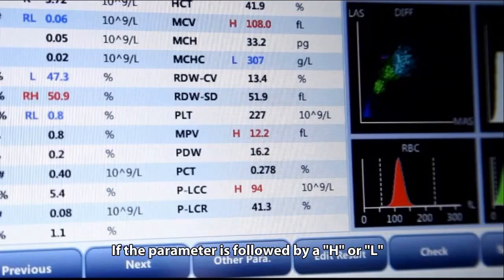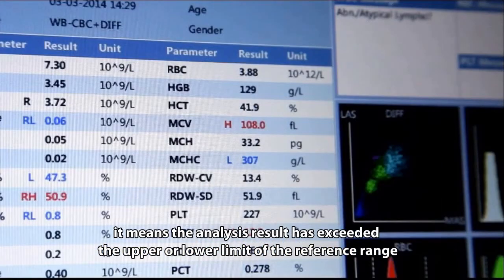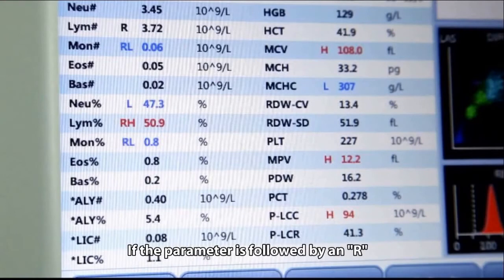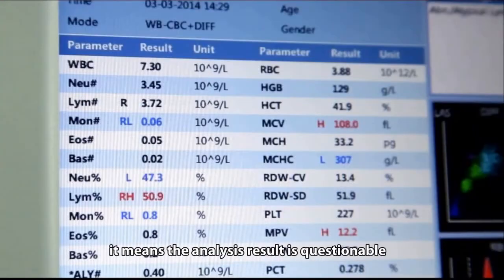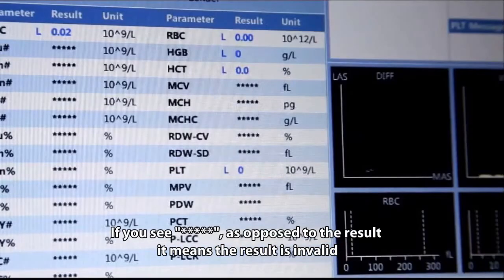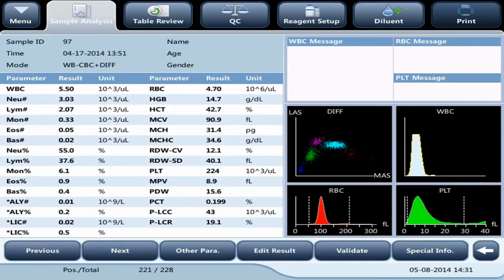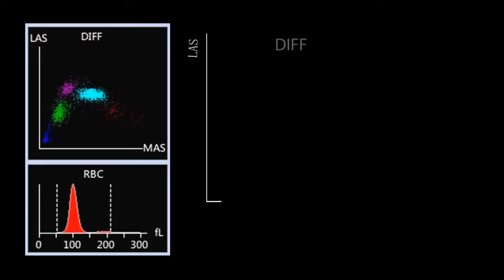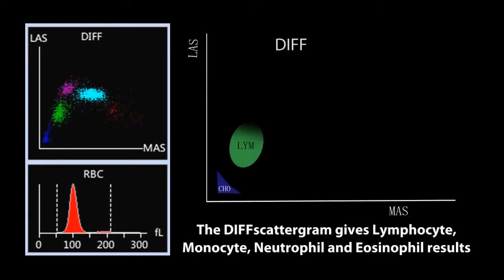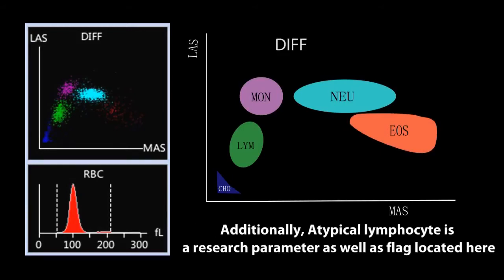If a parameter is followed by an H or L, it means the result has exceeded the upper or lower limit of the reference range. If the parameter is followed by an R, it means the result is questionable. If you see six asterisks (******) instead of a result, it means the result is invalid.